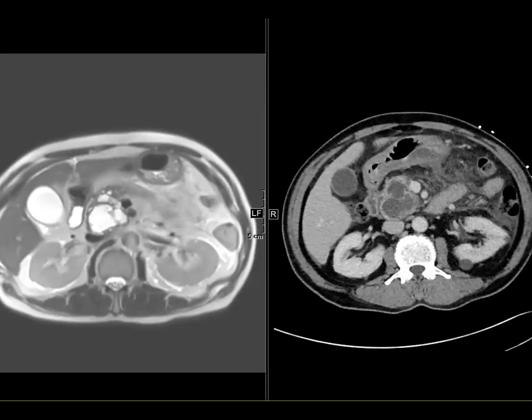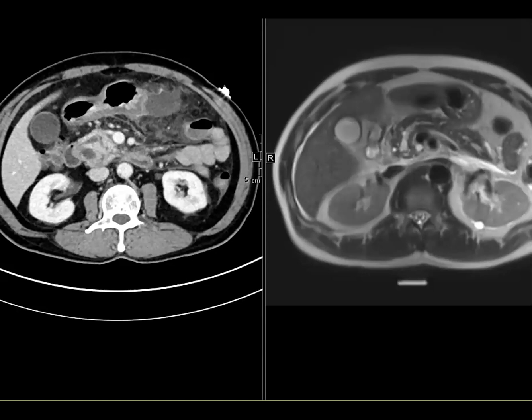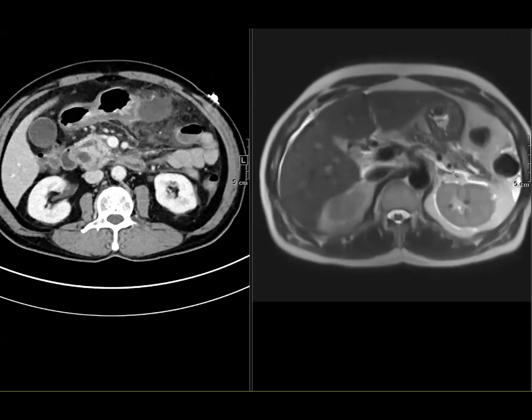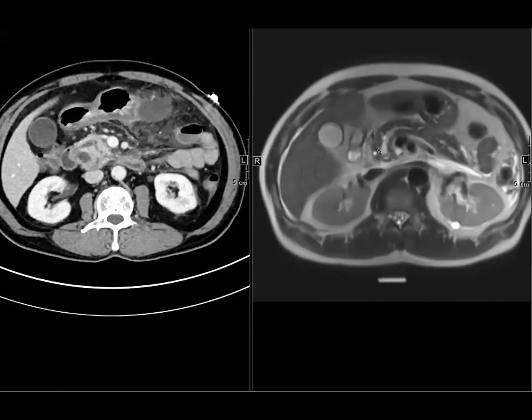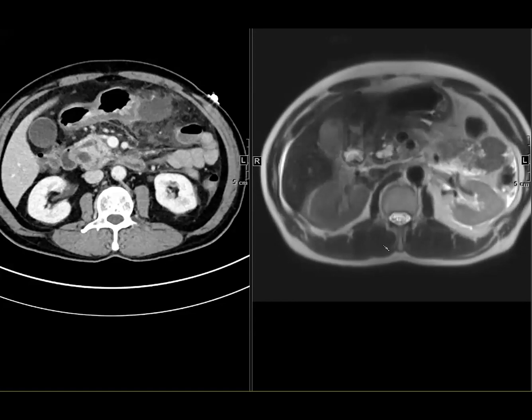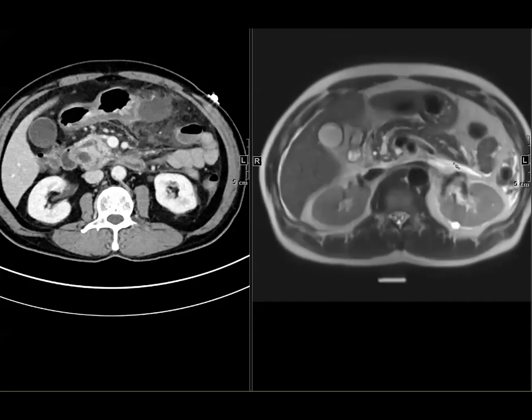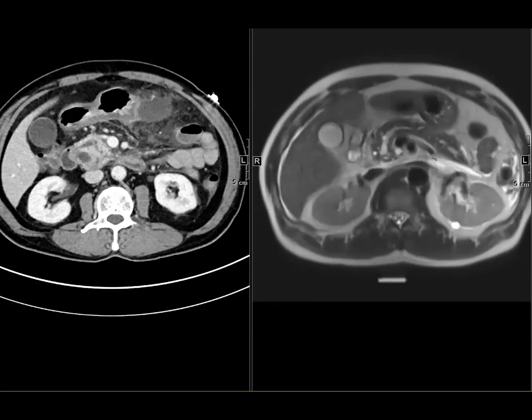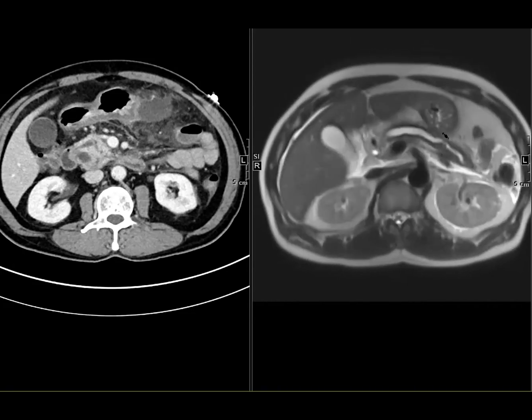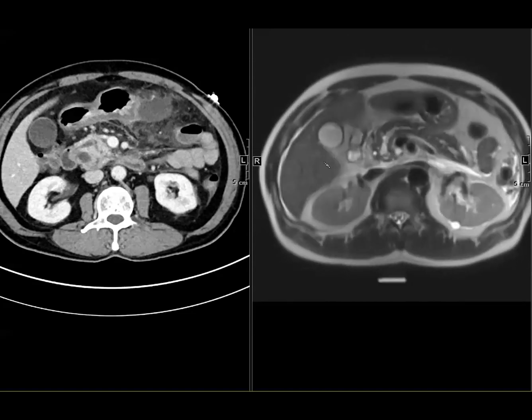And this is my last case. So this was years ago. This was the initial scan, and you can see that their pancreatic duct was dilated. There were some side branches that were dilated. And there's a lot of fluid around the pancreas, and clinically they were having pancreatitis. So at the time we thought this is probably some chronic pancreatitis. There was all this fibrosis of the gland, fluid around it. Clinically they had pancreatitis, so they treated them for acute on chronic pancreatitis.